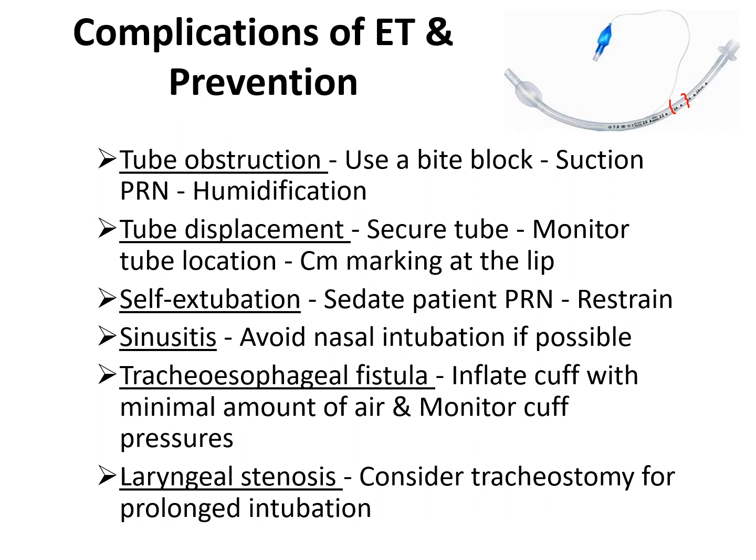Self-extubation, unfortunately, that can happen. The patient does it themselves, or if it accidentally comes out with turning, but we do want to try and sedate the patient to prevent them from trying to extubate themselves, and we use restraints if needed.